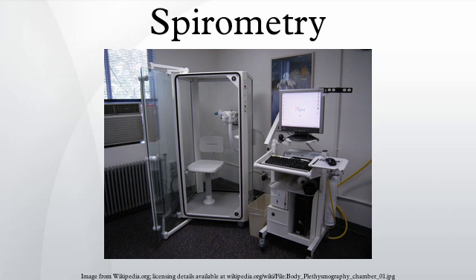Static lung compliance is perhaps the most sensitive parameter for the detection of abnormal pulmonary mechanics. It is considered normal if it is 60% to 140% of the average value in the population for any person of similar age, sex and body composition.